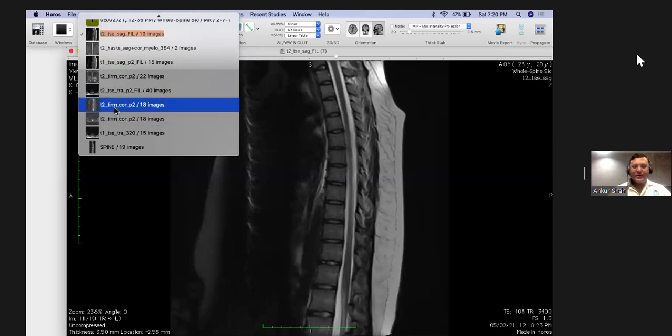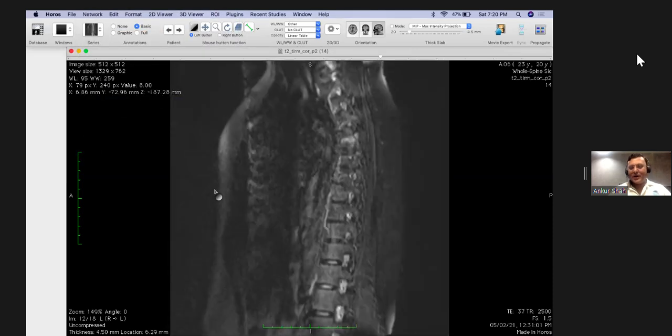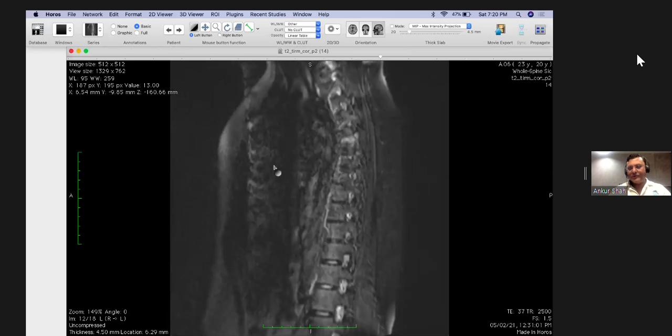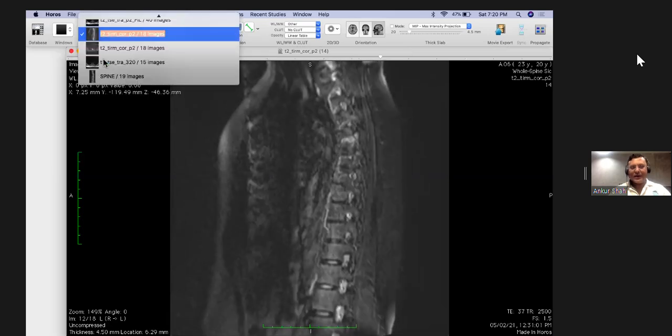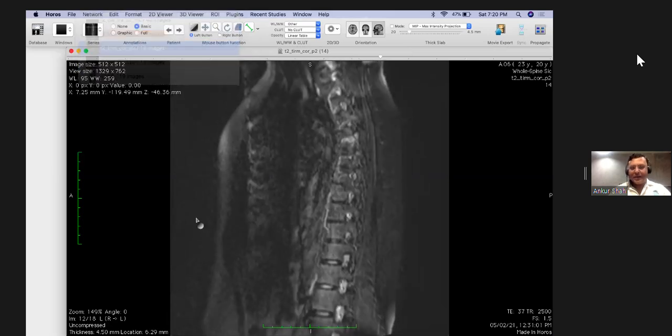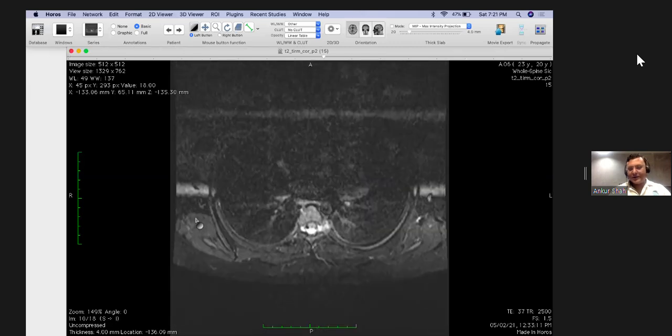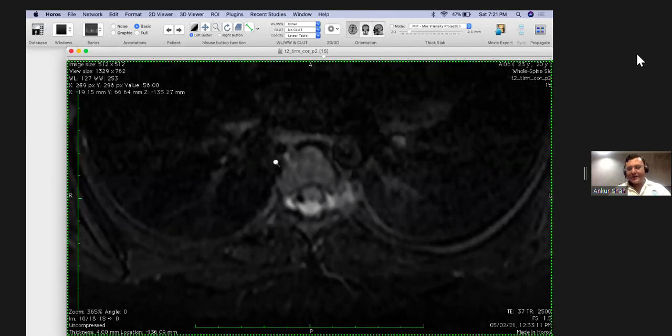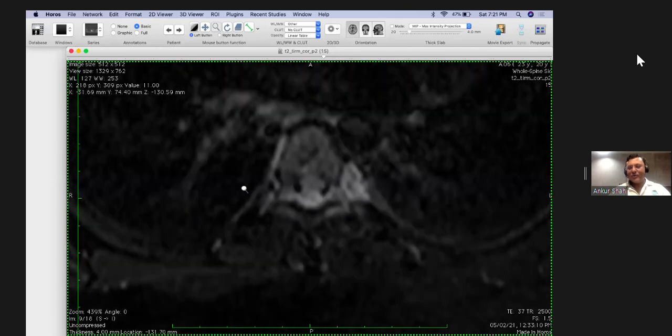Look carefully on the STIR images, particularly in the young individual. Whenever you see any abnormal area or a small focus of marrow edema, look carefully for that. Take detailed images for that. Take fat suppressed axial images, and what you might see is a small focus of marrow edema. And on CT scan, again, this was confirmed to be a small nidus, and this was an osteoid.